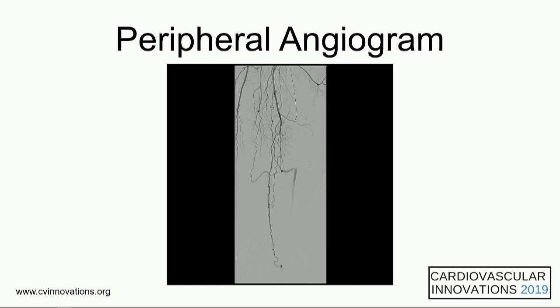So our colleagues attempted an endovascular approach. It was a standard approach. They used a 6 French Ansel, went up and over. And I believe they used a V18 and a support catheter. Never really escalated. You can see where they start. You can see the occlusion is not that long. Sure, calcified. I would say this is probably less than 20, maybe 6 functional. And they got pretty close.